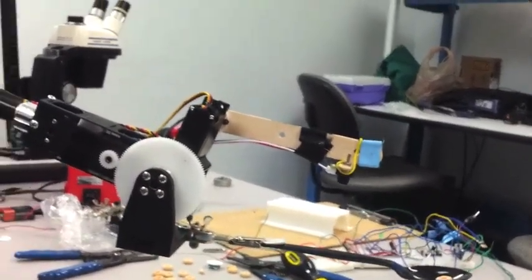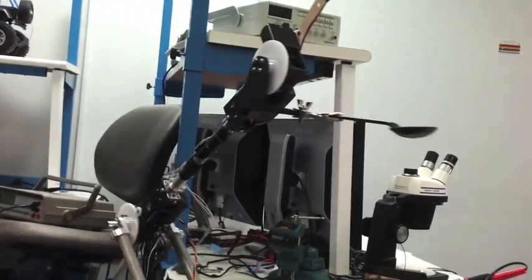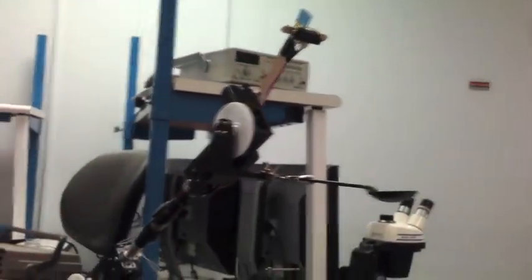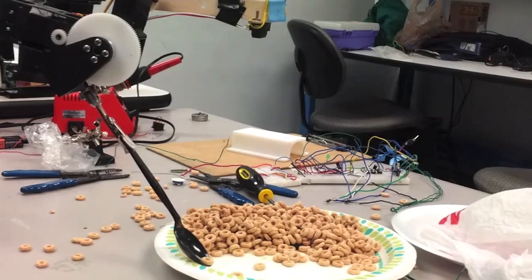It sees the same spoonful, so it fills it up. When I send it to the mouth this time, I'm going to put my hand in the way to indicate that the user's head, for example, might have been too close to the arm. It bounces back immediately as a safety measure to prevent the user from being hit or struck accidentally, then goes back to repeat the process of searching for food.